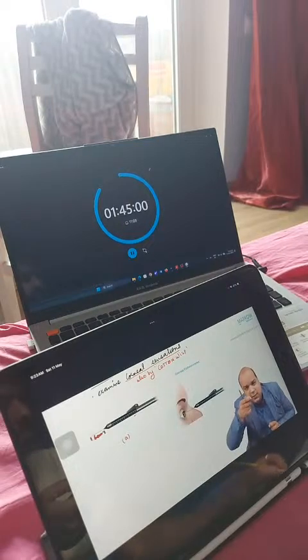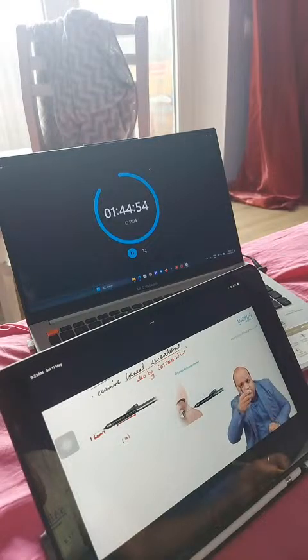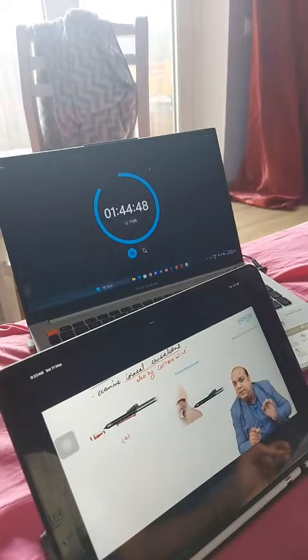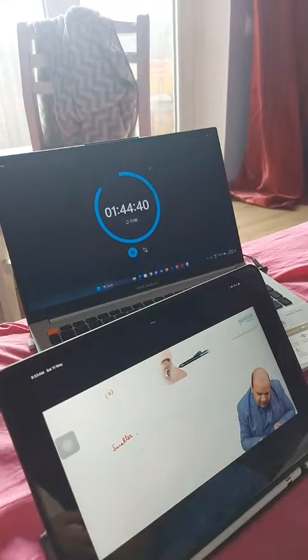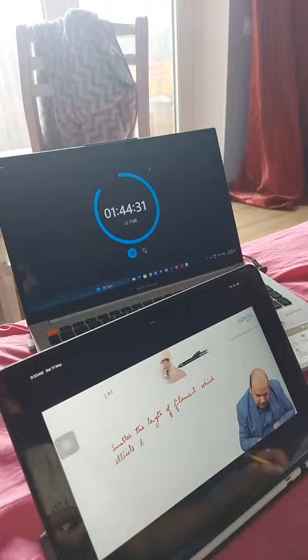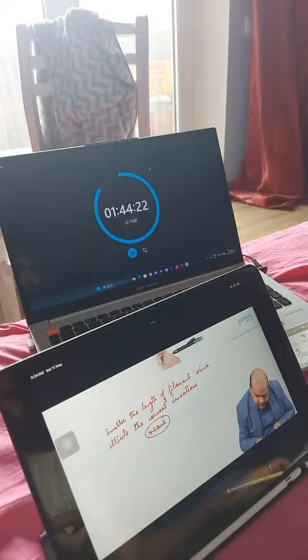If the patient is not able to feel the sensations, we retract. I hope you are able to see this scale here, everybody. Yes? So we are able to retract this filament. We retract it by 0.5 centimeter, from 6 to 5.5, 5, and so on. At whichever point the patient is able to feel the sensations, we record that. The smaller the length, that means more is the anesthesia. So I will write it for you. Smaller the length of filament which elicits the corneal sensations, it means lower the corneal sensations.